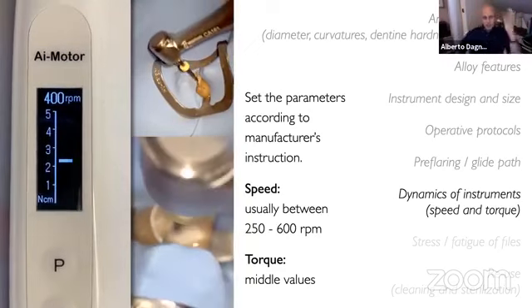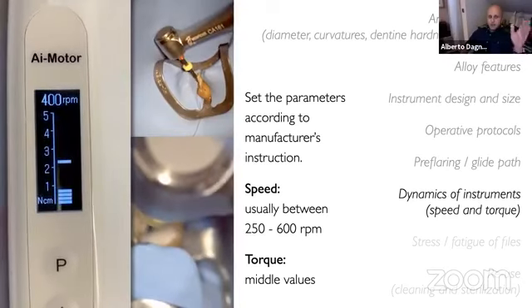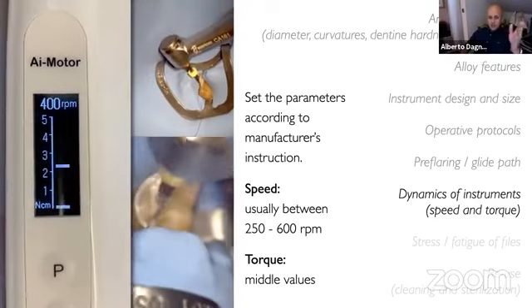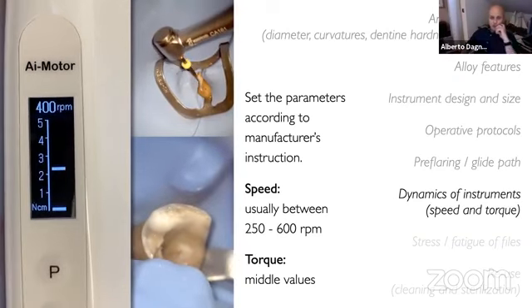So we have at our disposal electronic handpiece devices in which we can set the parameters of rotation, speed, and torque, respecting the manufacturer's instructions. We have to respect the minimum or maximum limit indicated by the manufacturer of the file, and set these values on the handpiece. Many handpieces have preset programs for each kind of file.